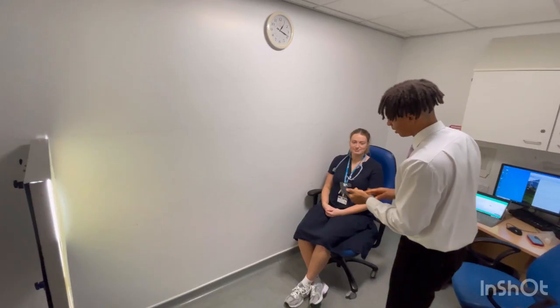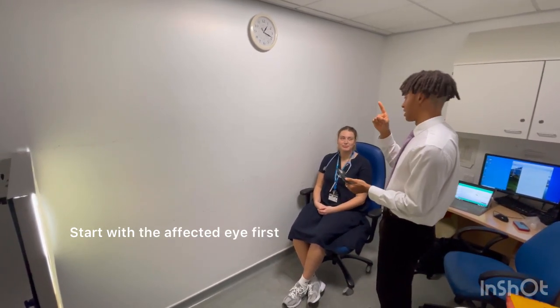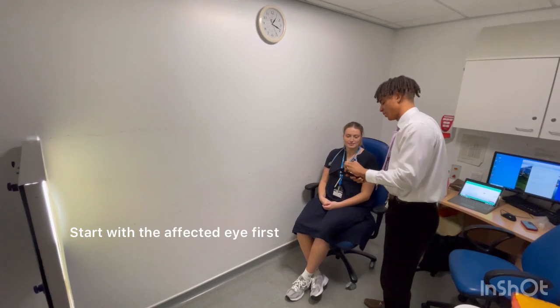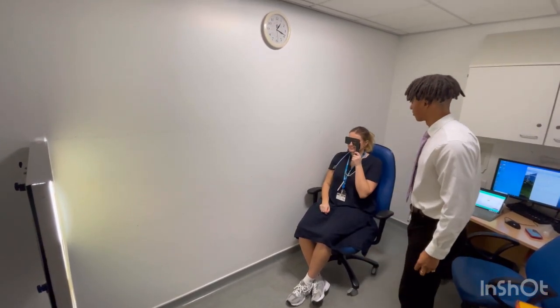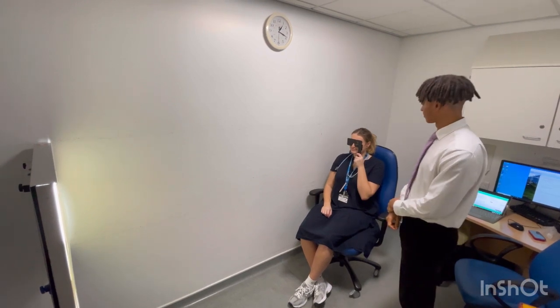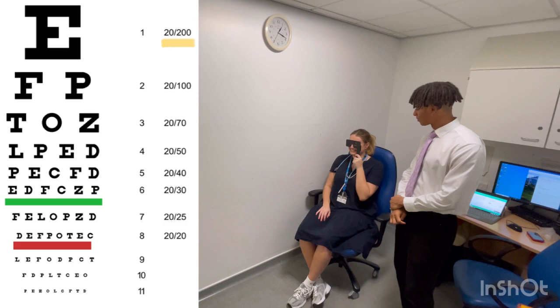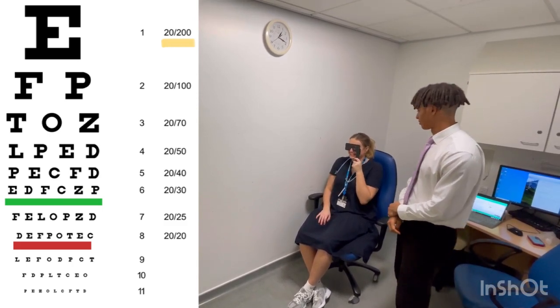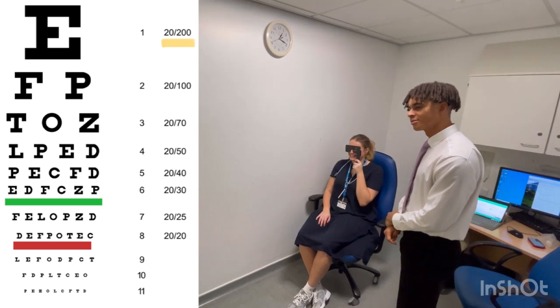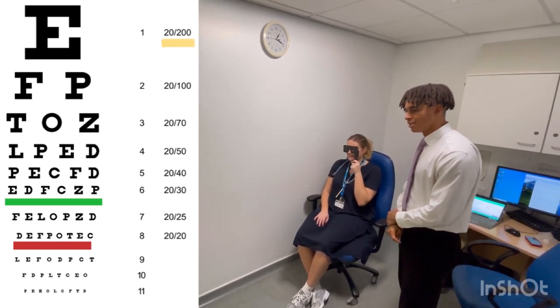So first things first, covering one eye using the vision occluder, ask them to read how far down they can read on the Snellen chart. If they can read every letter on that line, they are assigned the number to the right or to the left of that line. An example would be 20/200, which is the top line. What this means is that the patient can see at 20 feet what the average person can see at 200 feet. So that's not that great.